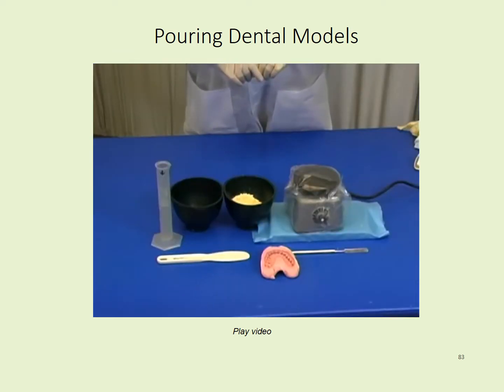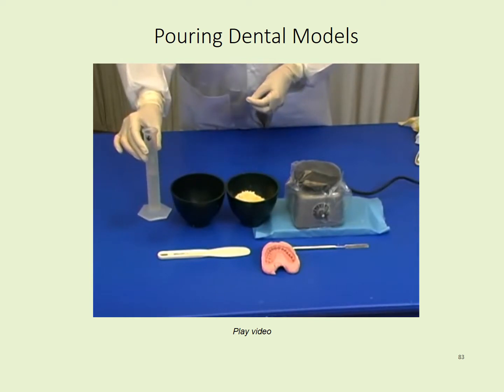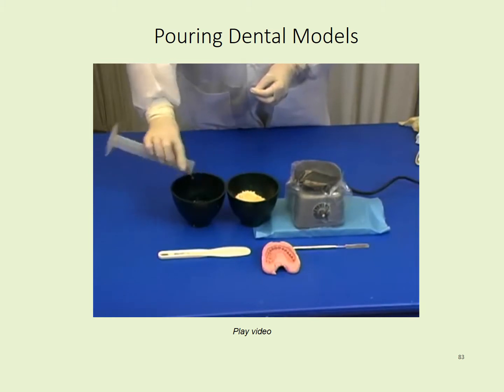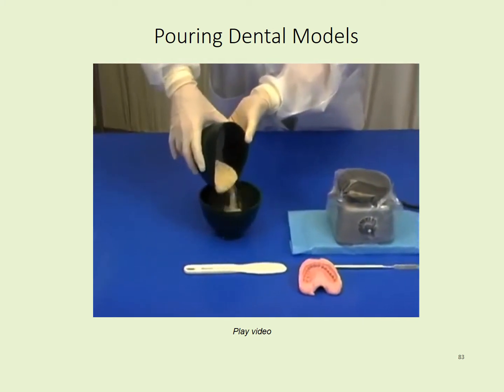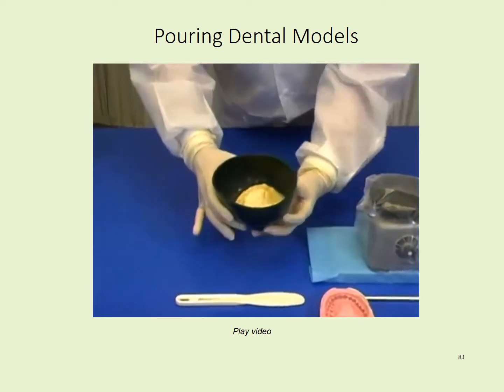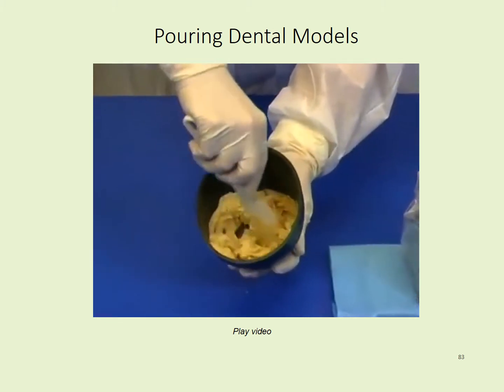The correct ratio of dental stone to water is 100 grams of stone powder to 30 to 34 milliliters of water. 34 milliliters of water is added to a rubber bowl. 100 grams of the powder is added until the particles become wet. Gently stir all the powder into the water to minimize the amount of air trapped in the mix.